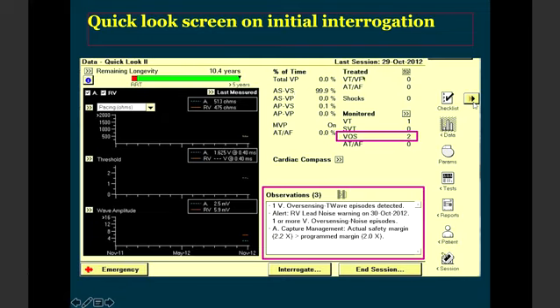This gives you an idea about ventricular tachycardia, ventricular fibrillation, or atrial arrhythmias that are treated by the device. None in this particular case. Monitored episodes: monitor meaning collect the data but don't treat. That's called monitored. You keep a slow VT usually as a monitor. If you see that, there is one episode of a slow VT which has been monitored by the device.